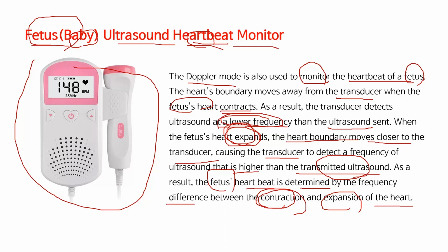One more time. When the heart is contracted, that means the heart boundary is moving away from the detector, so we can measure that the frequency of the ultrasound wave is lower than the sent ultrasound.